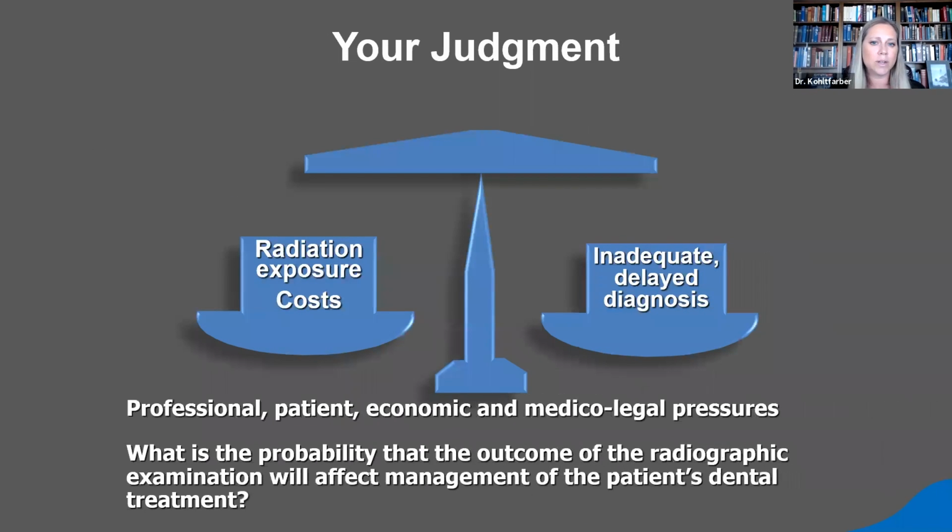All right, what does this all boil down to? If you're looking at that going, wow, when should I take a scan? Just know it all boils down to your judgment. We're not sitting in your dental office. We don't know. If you feel you need it, it's completely up to your judgment.